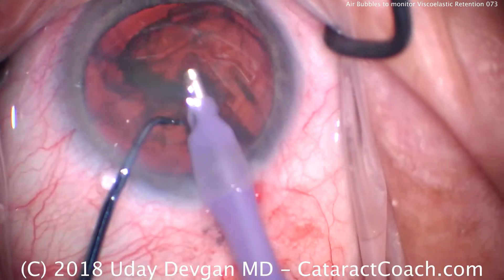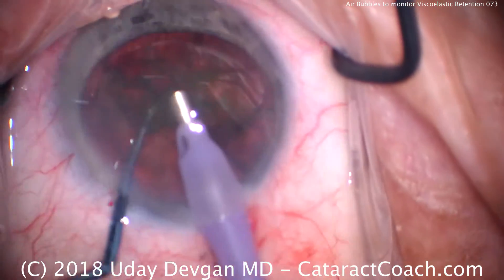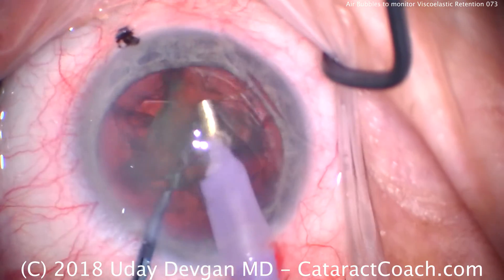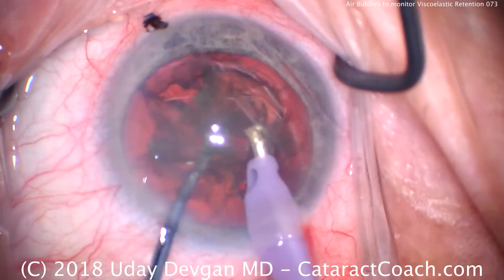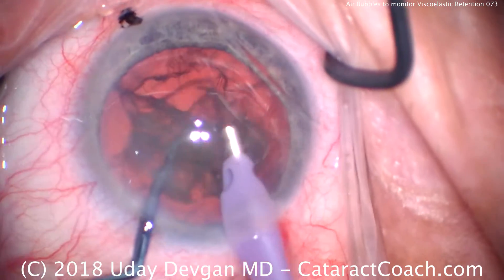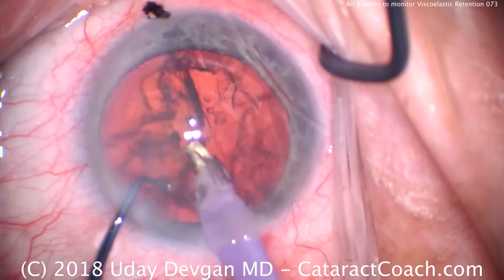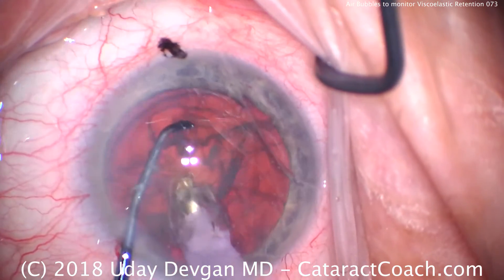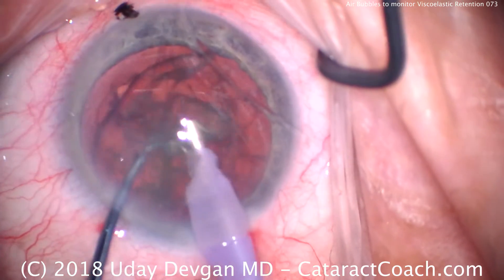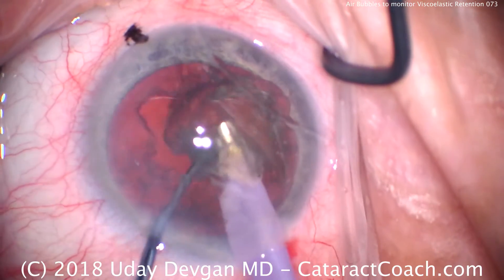As the halves are separated, we bring the first half up into about the iris plane and aspirate it. We can determine whether we are losing viscoelastic during this portion of the procedure, or whether we're maintaining a coat of the dispersive viscoelastic on the corneal endothelium. First half of the nucleus is out; here comes the second half. Buzz in with the phaco probe, bring it towards the center, chopper goes around to chop off a piece.